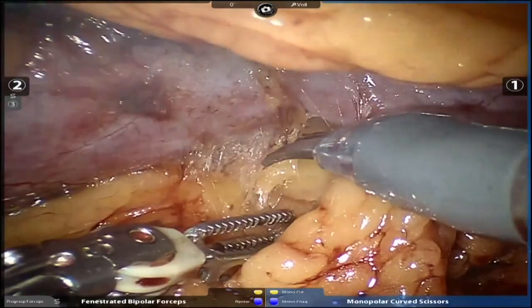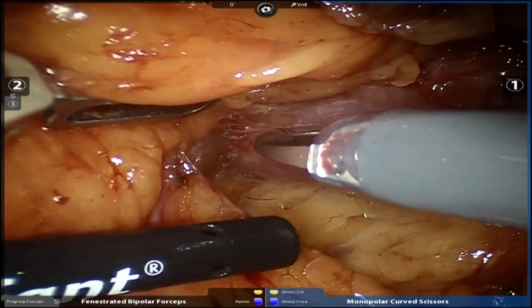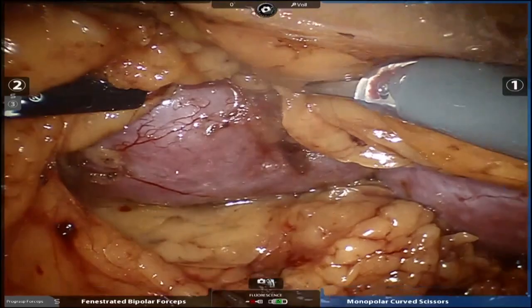but we have to be able to operate anywhere because this is challenges, so we can't have everything all the time, so that's fine. And what is the maximum flow your insufflator gives you? 40 liters? 40 is the maximum. That's what the machine says, but the reality is you're going through a port that has another instrument in it already, so the maximum flow is well below that. The maximum flow depends on the caliber of the port with what you have in the port. And if you have something like a 5mm instrument and a 12mm port, then it's going to limit your view.